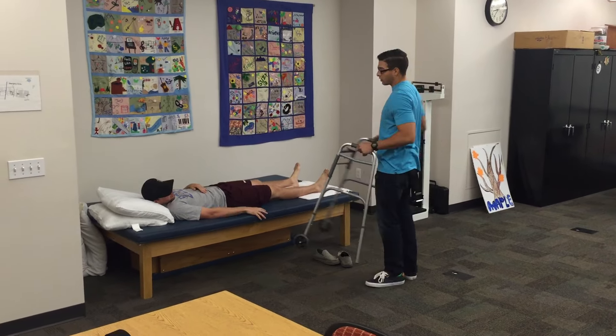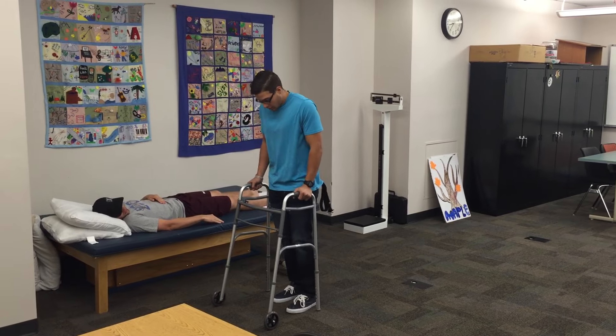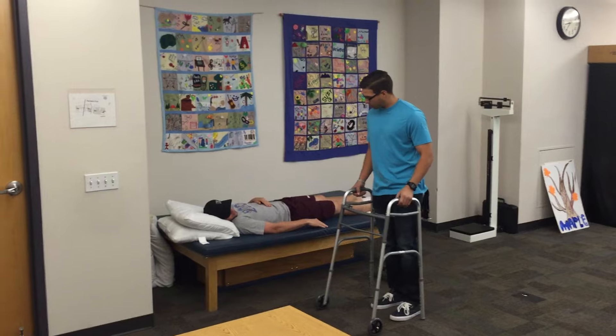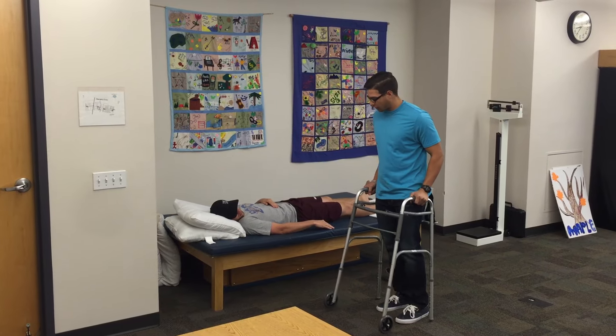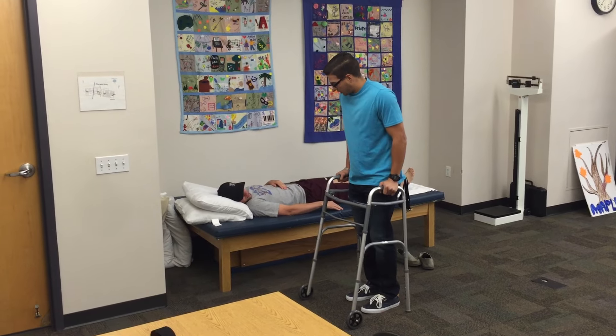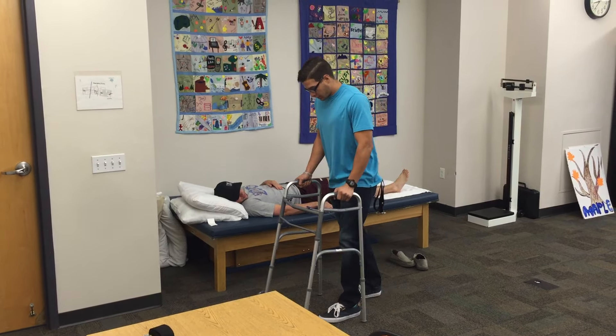So a couple of things with the walker here when we're going to be walking. You have partial weight bearing in the left — not all your weight, but a little bit of weight is tolerated. So when we start walking, we're going to go forward with the walker, your left leg, and then your right leg. Just like that — nice and small.